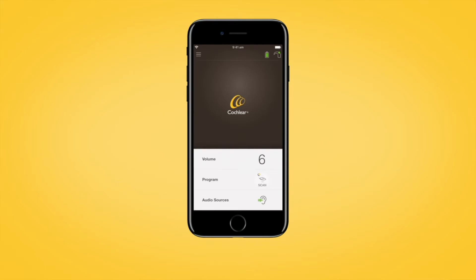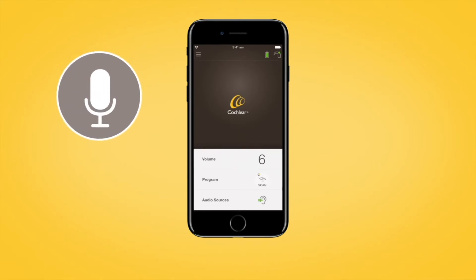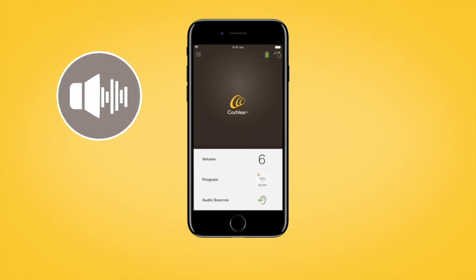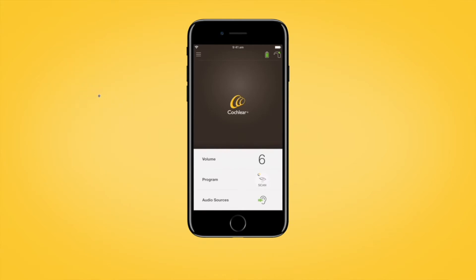The Nucleus Smart App also allows you to adjust the sensitivity, bass, treble, and master volume limit levels of your sound processor, if this has been enabled by your clinician.